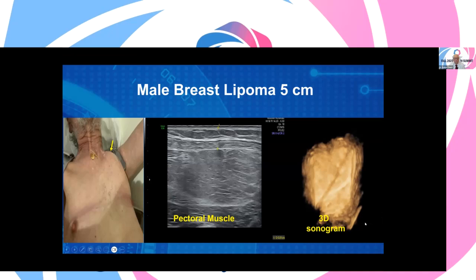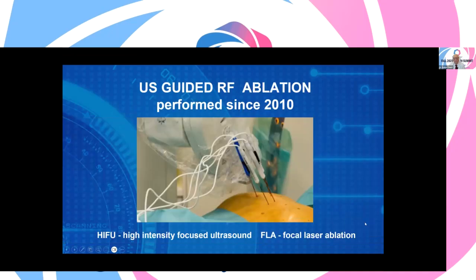Next slide, please. This is one of the many ways of ablation. Ablation has been used for the past 40 years now. This happens to be radio frequency ablation. Like I said, when you have the 3D picture, you know how wide it is, how deep it is, which guides you where to place the needles for ultimate thermal ablation and destruction.